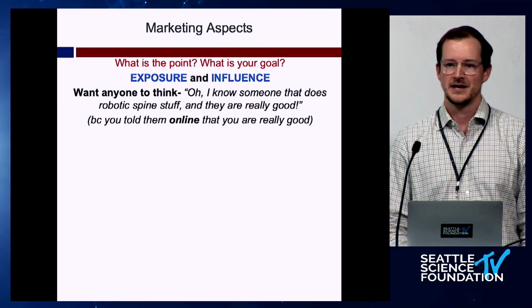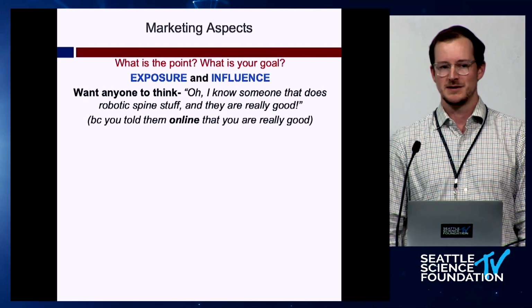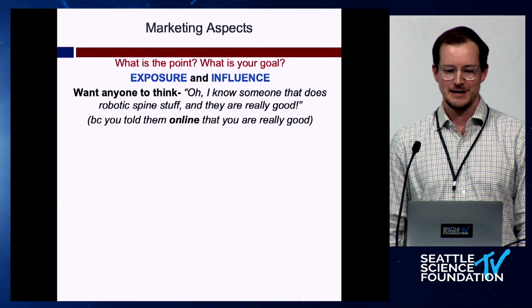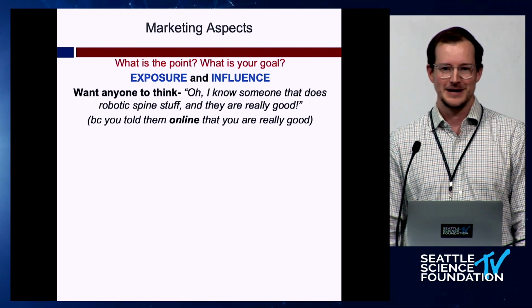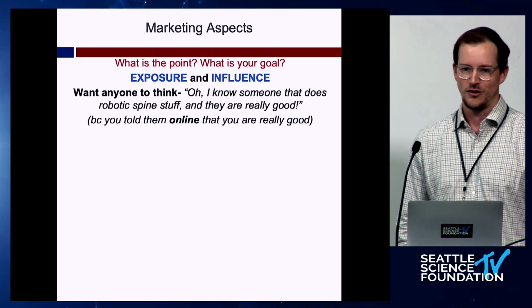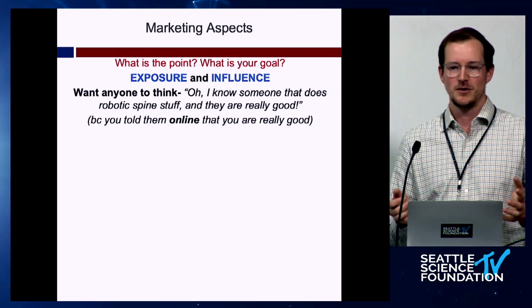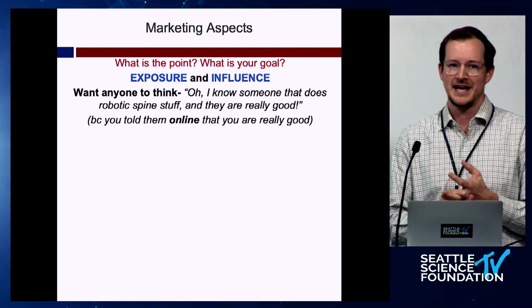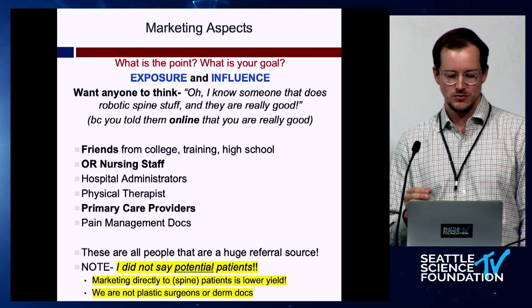But one of the things I think the robotic technology does, for the ortho people in the room, we all know about joint replacements with a hip and a knee. And if you're ortho trained, you know that the studies are about the same for getting a knee replacement with the robot versus without. But I kind of want the robot. It sounds great, right? Even if I know the studies, I want a robotic knee replacement just because that sounds more fancy. It's kind of the same thing in spine surgery. If you are comparing spine surgeons, if someone's using a robot, that implies they're doing technology. It implies they're advanced. It implies less pain. It implies faster rehab, because robots sound cool. So I think that's one of the key things to robotic technology.